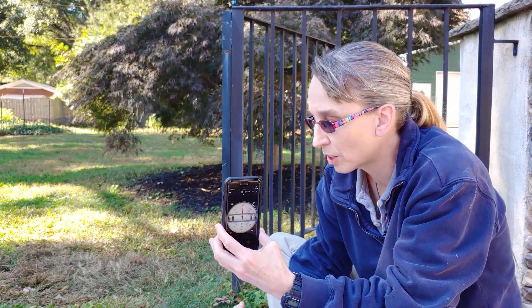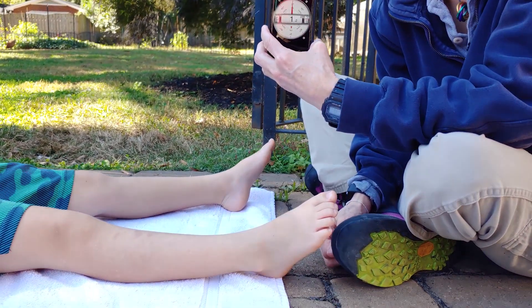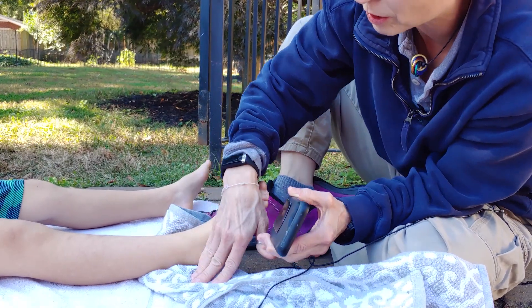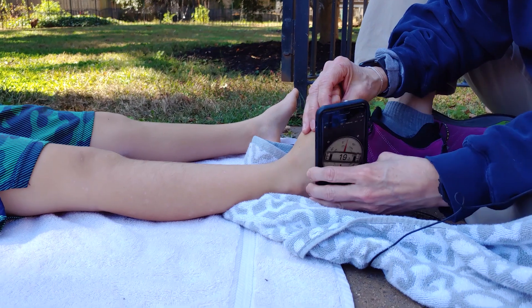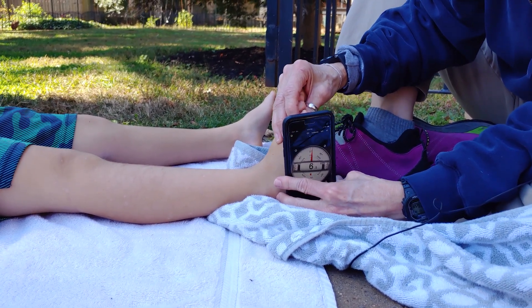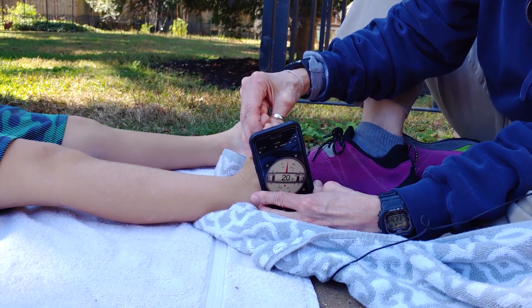You have to make sure that your lower leg is totally parallel to the ground to get a good measure. Sometimes that means I have to prop up the ankle just a little bit if they have a big calf. I get the foot into neutral so it's pointing straight up toward the sky, starting at about zero degrees. Then I see how far that foot can go up — and we can see we've got 15, 18, 19, 20. So 15 to 20 degrees is normal.